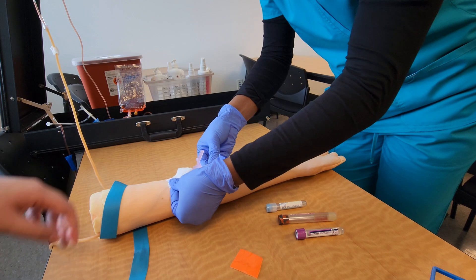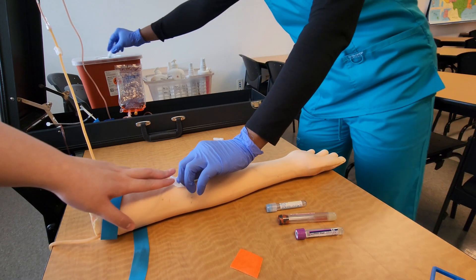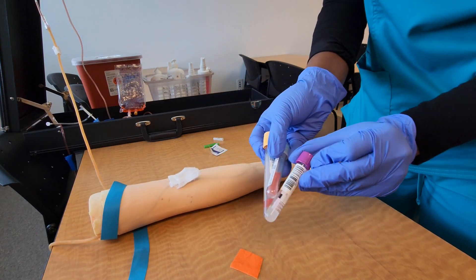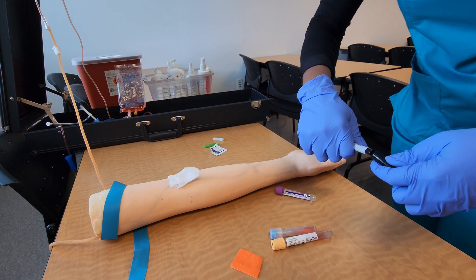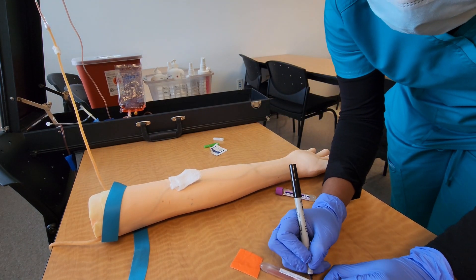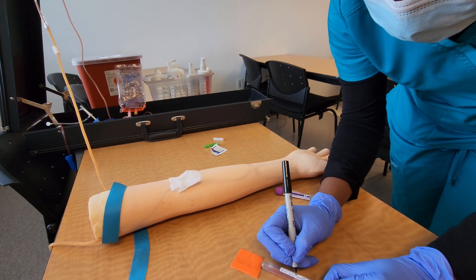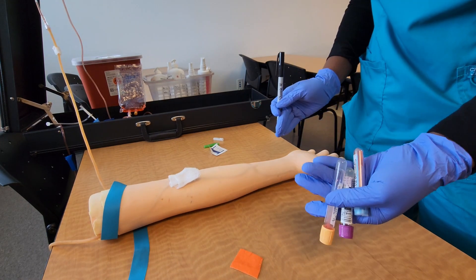I'll take out my last tube, release the tourniquet, and remove the needle while applying pressure to the puncture site with the gauze. I'll activate the needle safety device and place it in the sharps container, while asking the patient to hold pressure on the puncture site. Don't offer a band-aid yet — you want to keep pressure on for at least three to five minutes to make sure they've stopped bleeding.